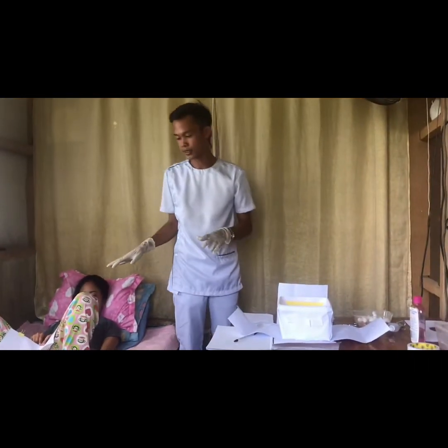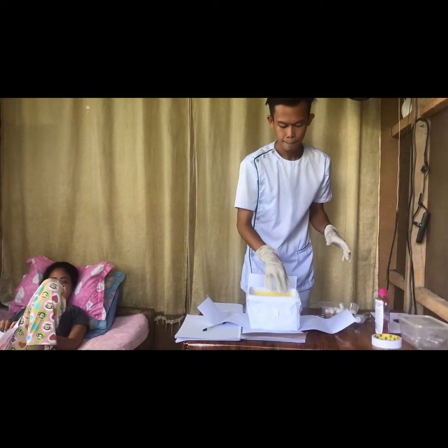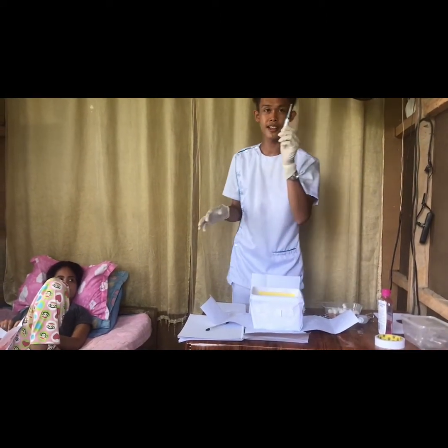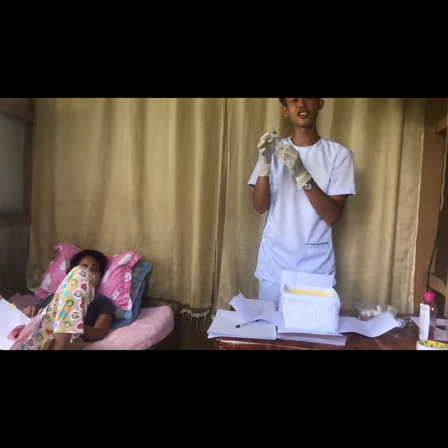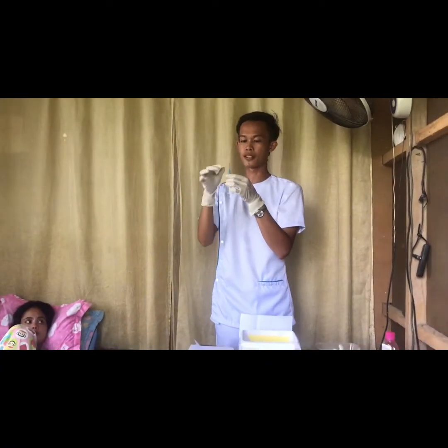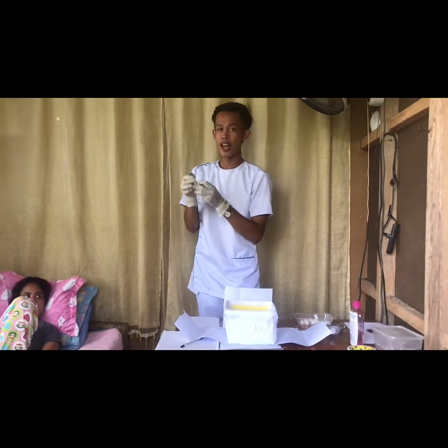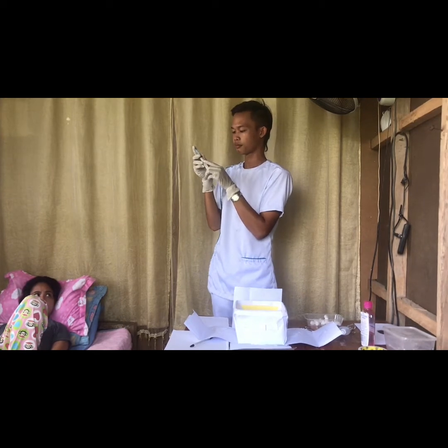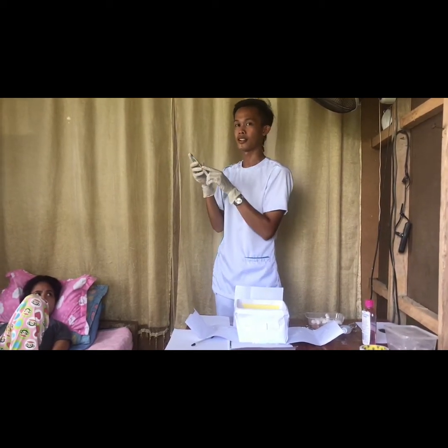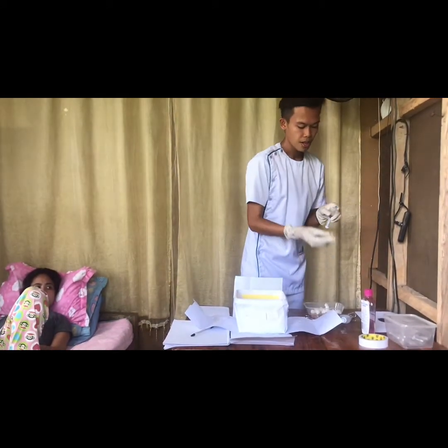Okay, now the fenestrated drape itself is intact. The next thing we're going to do is take the sterile gloves. This is a 10 cc syringe which contains distilled water. This time I'm going to detach it, and then pull it back to break the tip of the syringe, which contains 10 cc distilled water. And then after that, we're going to set it aside.